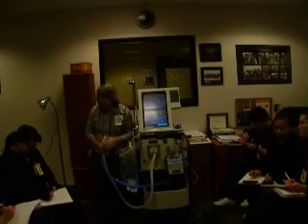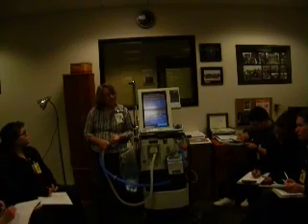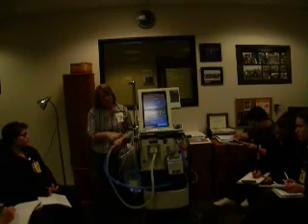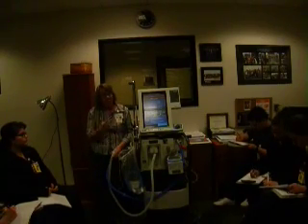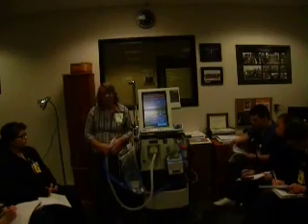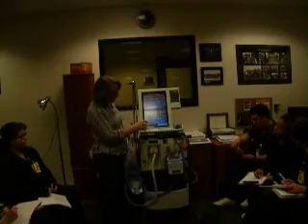Say your patient is in the ICU going to surgery and going to come back to that room when he's going to go back on the vent. Yeah, transport is another one. You don't want to have to reset everything, so you put it on standby. It'll pause everything, but keep all your settings. On this one, the same way you can do that is just do same patient. So this has no standby, so if you're going to take it off a patient, but you're going to be using it on the same patient when they come back from wherever it is they went, then you just turn it off. When they come back, you use same patient, and it'll have all the same stuff that it had before.